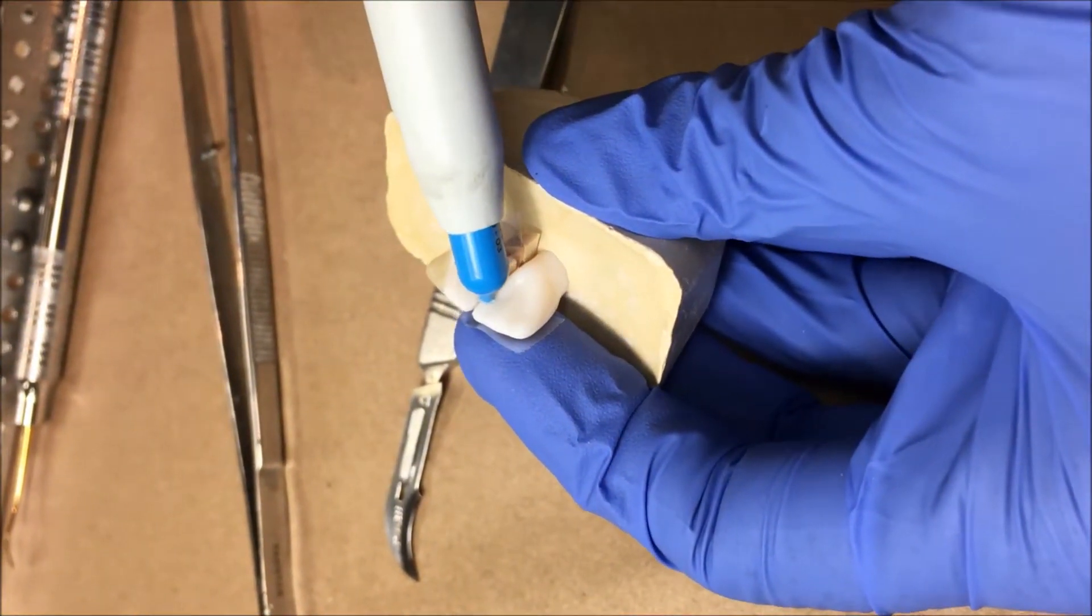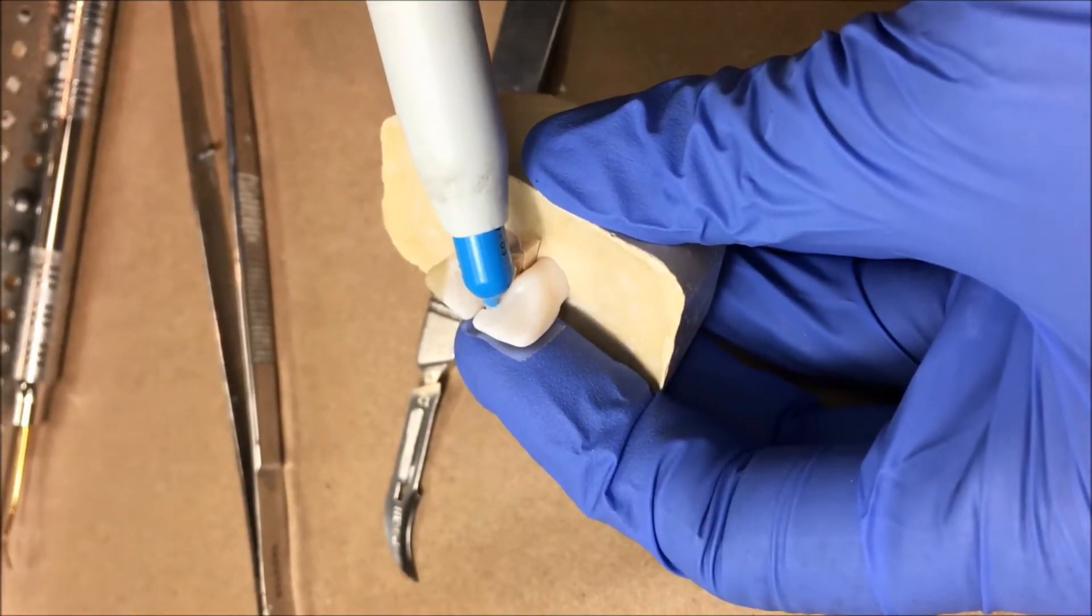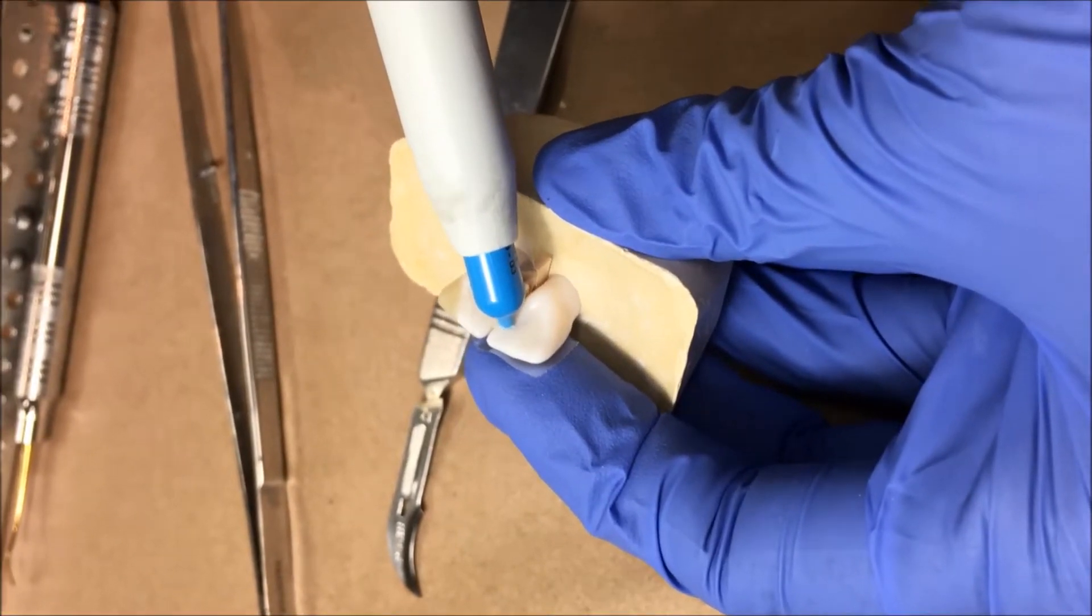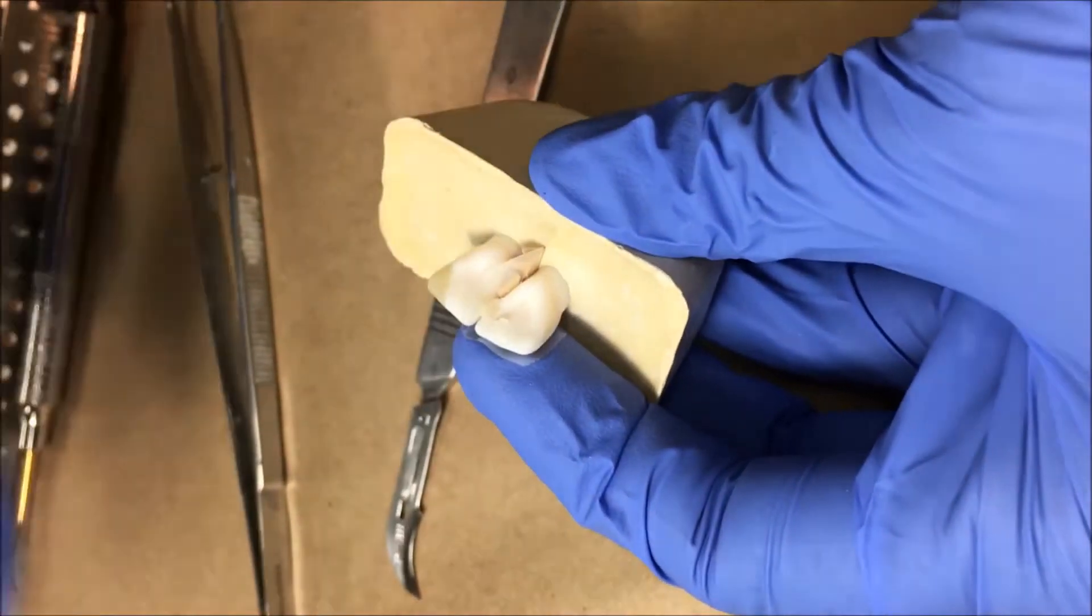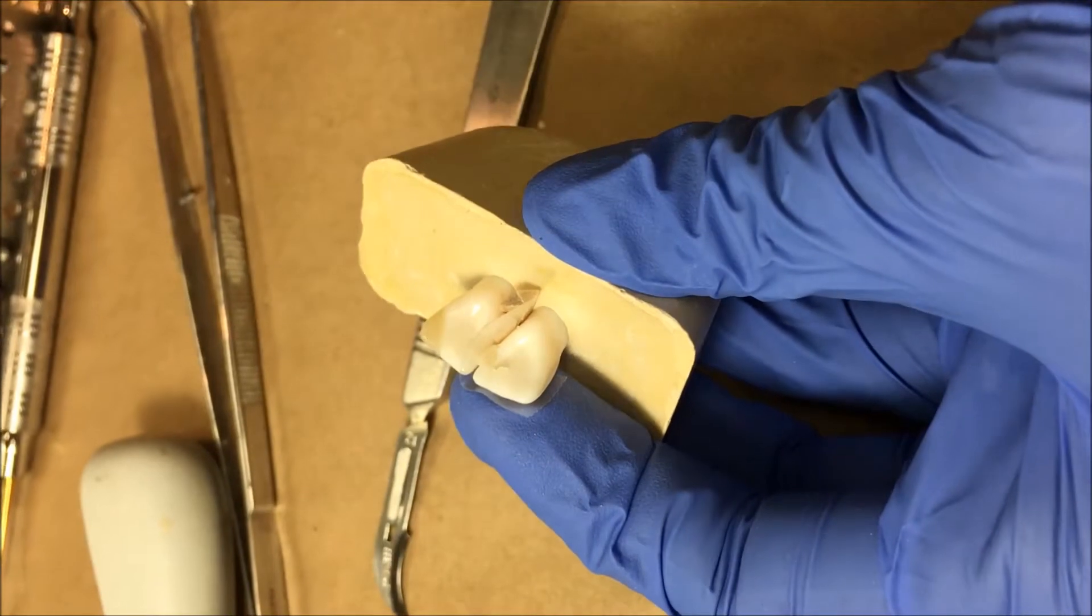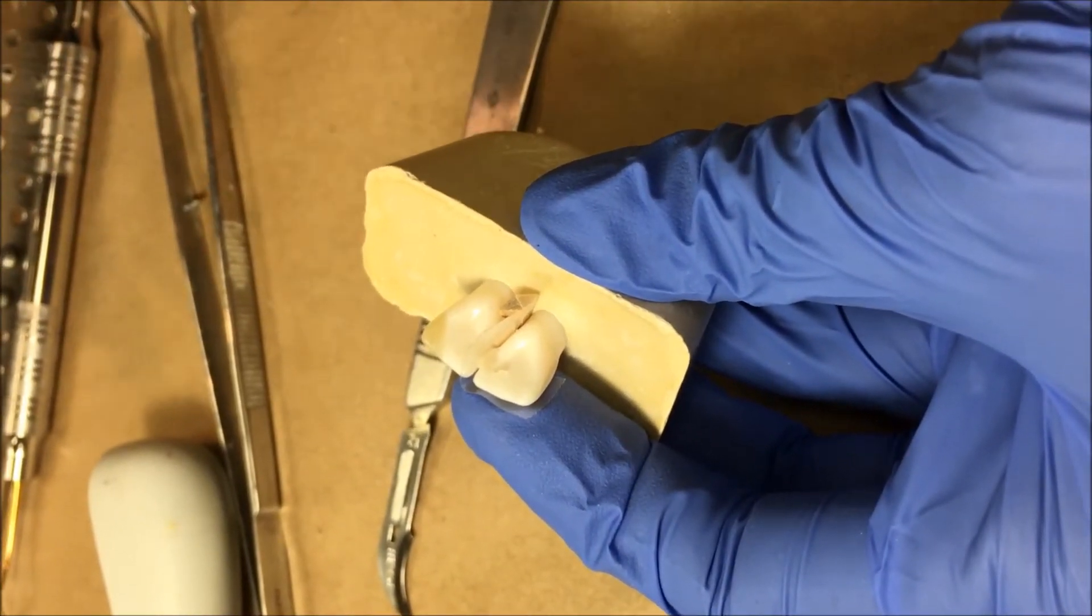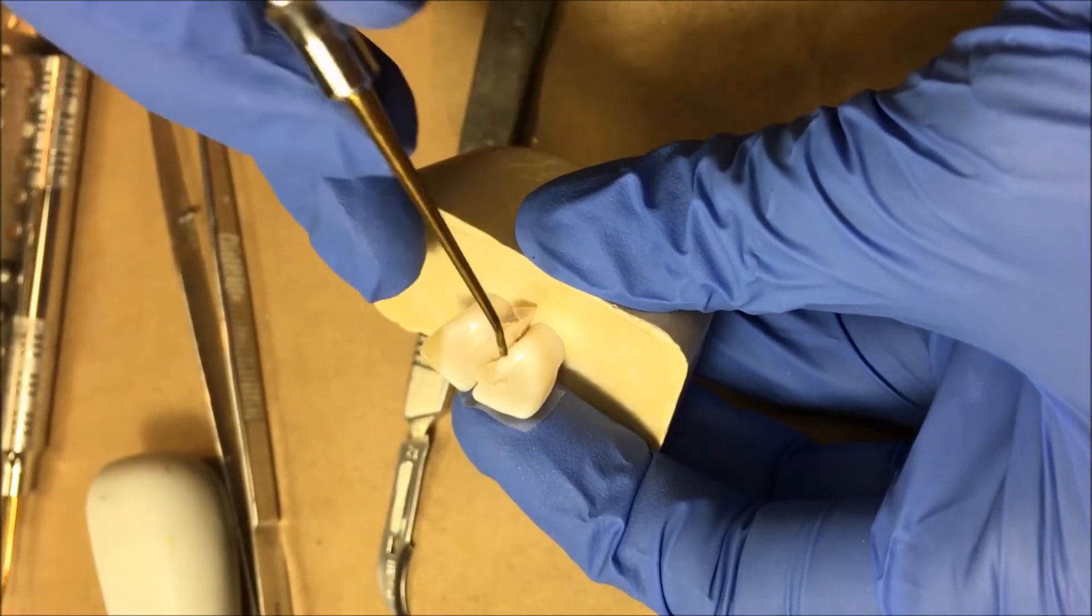Because this is so tiny and incipient I should be able to just bulk fill this. Notice that Dr. Hasland is putting the composite gun as close to the prep as possible and using the back pressure of the composite to fill the entire prep.